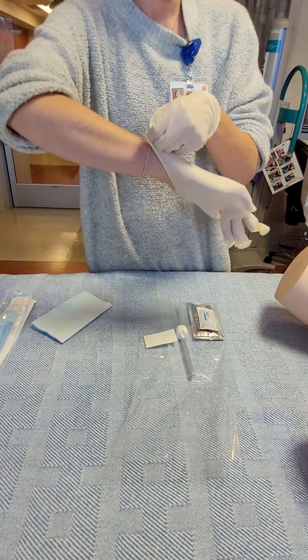Go ahead and put some of your lubricant down. Have your assistant drape that sheet underneath the patient so you don't get any on the bed. In the meantime, keep prepping your supplies — your package is open and ready for you to grab.